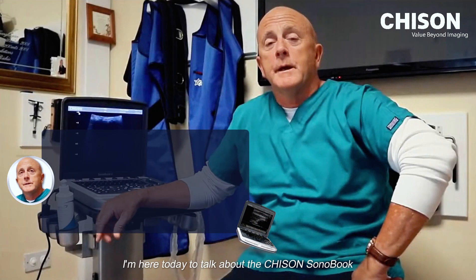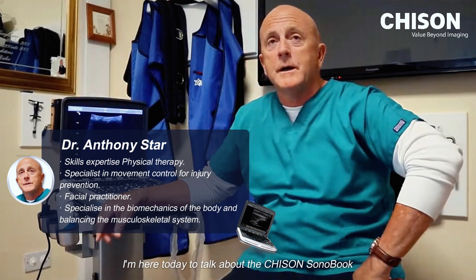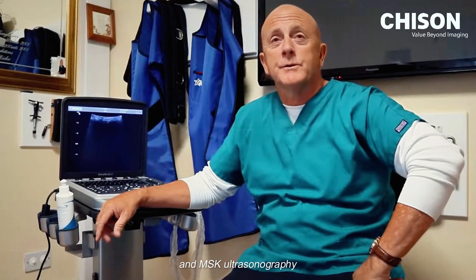My name is Star, I'm from Ireland. I'm here today to talk about the Chisong Sonamuk 6 MSK Ultrasound Machine.